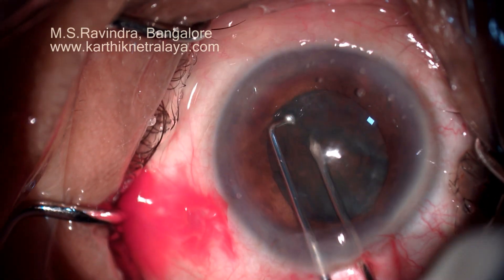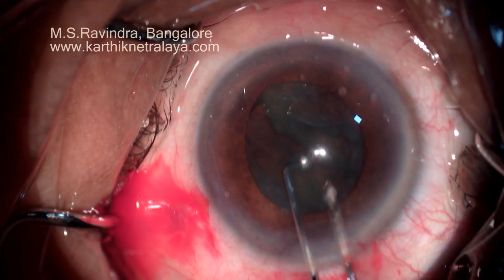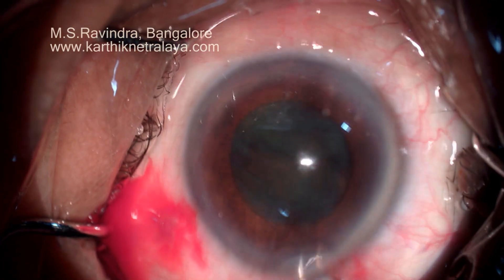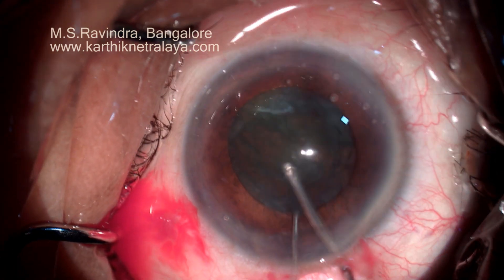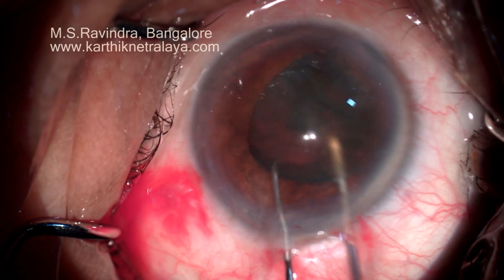Loose cortex is aspirated. The nucleus is bisected within the capsular bag. There is slight movement of the nucleus-epinucleus mass.